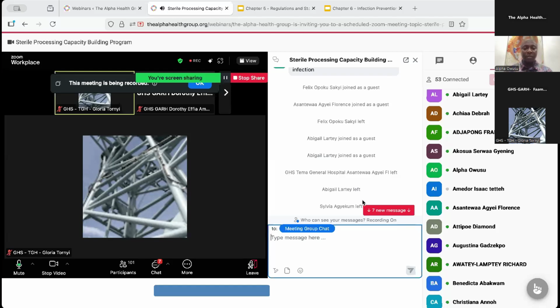Treating the instrument per each process, where you inspect them, clean them per the manufacturer's instructions, clean them properly using the right tools. The right tools can be brushes, water. Water is very, very important. Wearing these PPEs, cleaning them, and if it is not clean, it's not sterile. If it is not clean, it's not sterile. This is food for thought that I want us to put in our heads. Now, let's go to our homes, right?